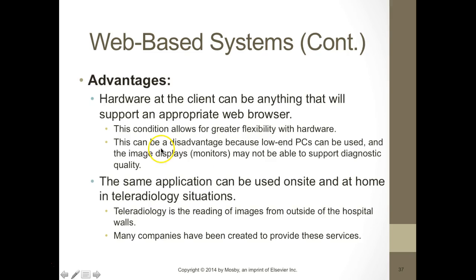So the advantages are the hardware at the client can be anything that will support an appropriate web browser. So this condition allows for greater flexibility with the hardware. This can also be a disadvantage because low-end PCs can be used and the image display monitors may not be able to support the diagnostic quality that we are acquiring.